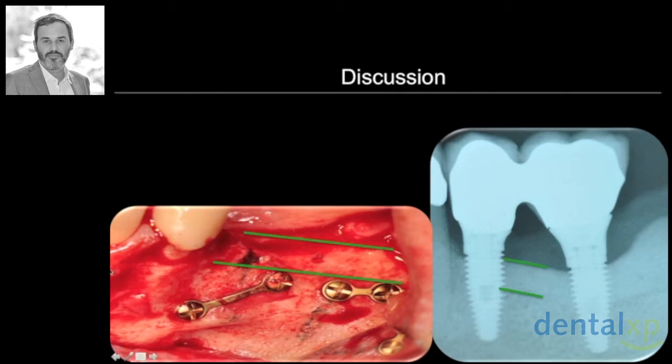In particular, the quality of regenerated bone around the neck of your implants, especially in the posterior mandible.